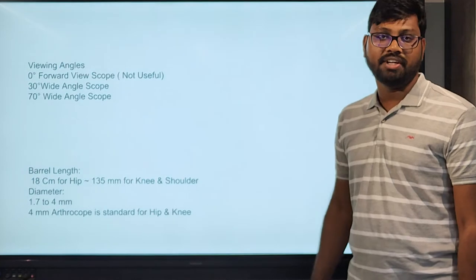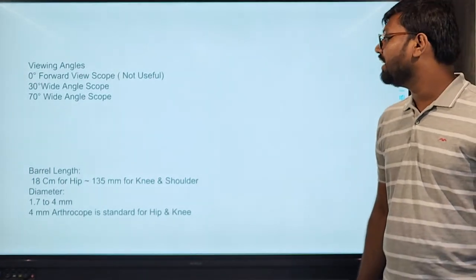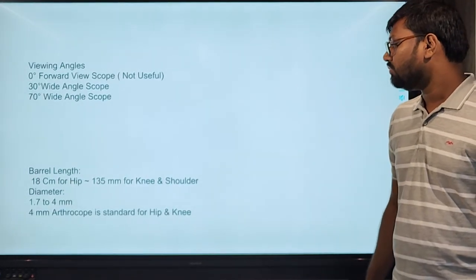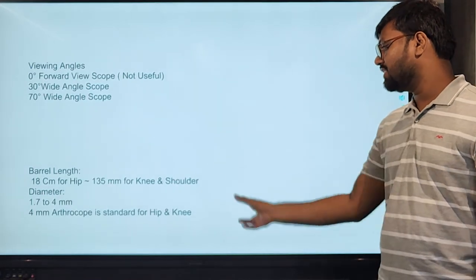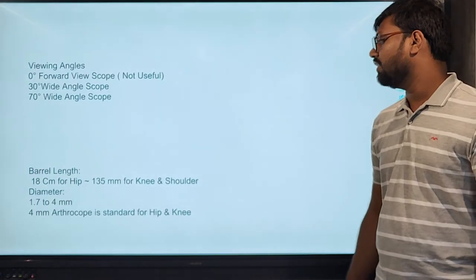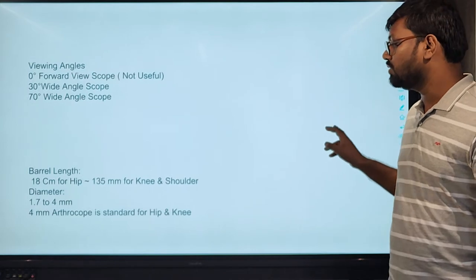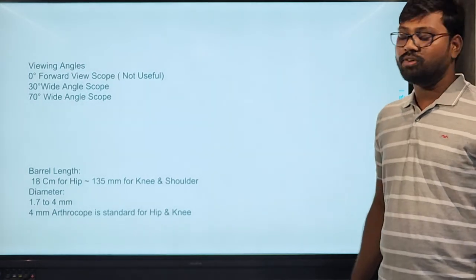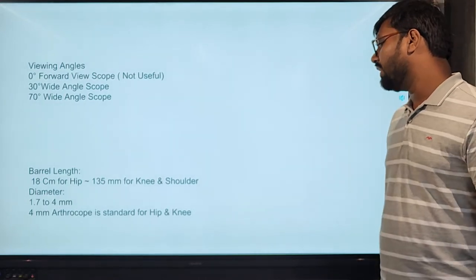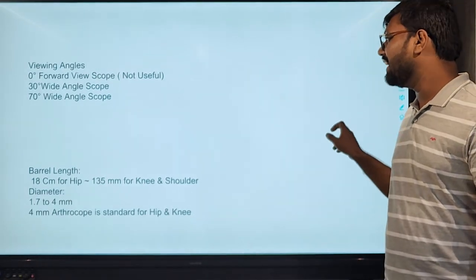There are different viewing angles. The 0 degree forward viewing angle is not used in routine arthroscopy. The 30 degree wide angle scope we use routinely, and there is also a 70 degree wide angle scope. The barrel length varies with procedures, with longer barrel lengths like 18 centimeters for the hip, and an average of 135 mm for knee and shoulder arthroscopy. The diameter also varies from 1.7 mm to 4 mm. The 4 mm arthroscope is standard for hip and knee arthroscopy.